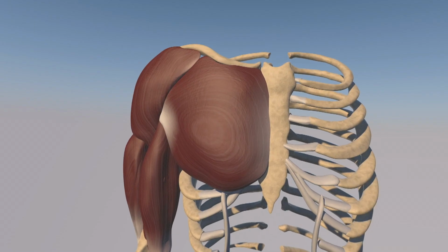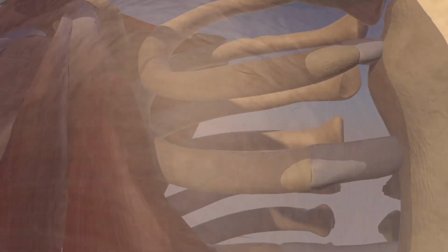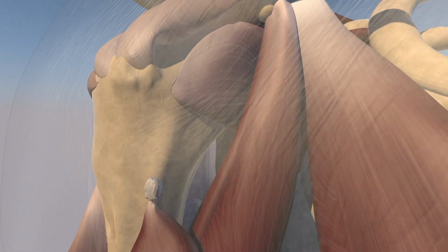Here we're going to go over this patient that has a torn biceps tendon with calcification near its stump, as well as tendinosis of the subscap tendon, as well as a partial articular sided tear of the supraspinatus tendon. Here you can see that tear of the supraspinatus tendon on its distal articular aspect, as well as thickening of the subscapularis tendon. Also, you can note irregularity of the superior facet of the greater tuberosity. And you can appreciate a stump on the long head of the biceps tendon with calcification right near that stump.